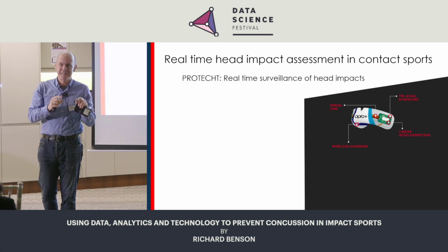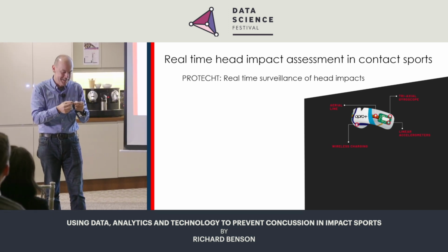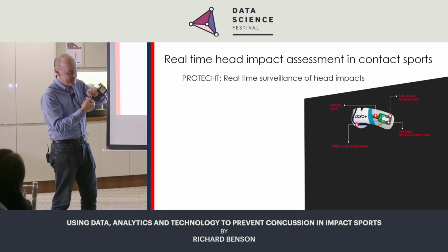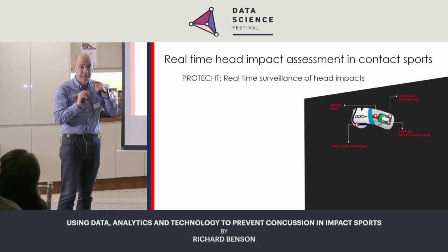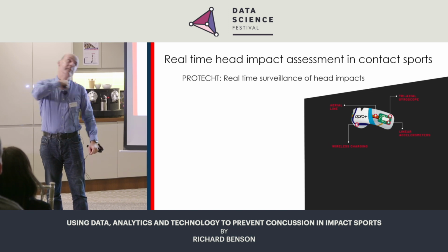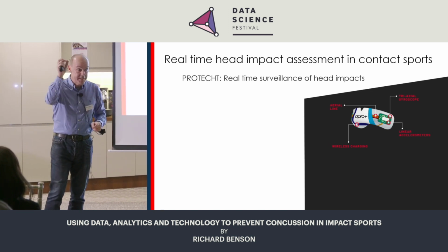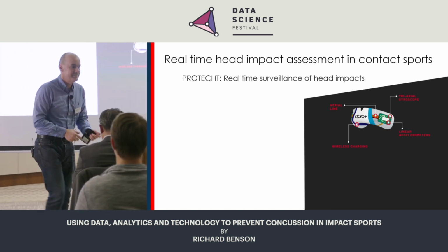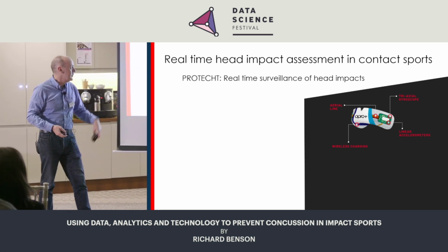That's actually the aerial. Sorry, is this only interesting me? It's a good chance it could be. That's the battery, they're boring. You can see two tiny little chips down here. They're the important bit, that's the gubbins. That is the linear acceleration, X, Y, and Z, and it's also the rotational acceleration, bang, head moving around. So that's what to look for. Have a little look at that and pass it round. Label diagram up there, all what I just said.